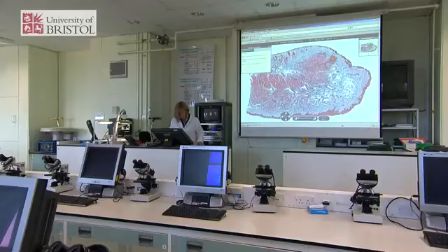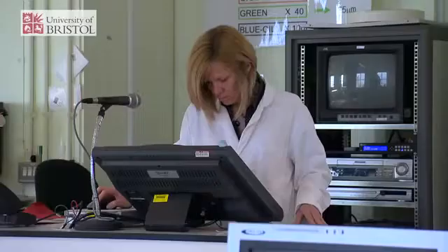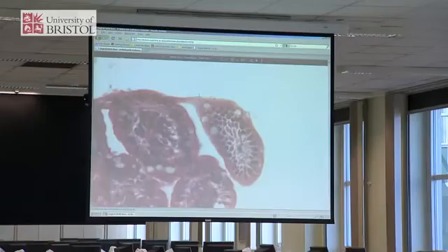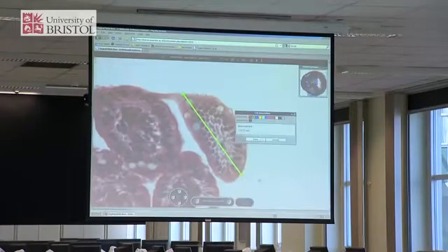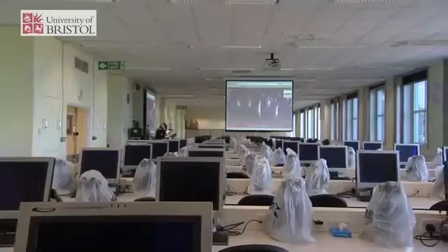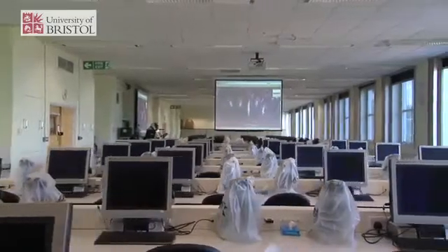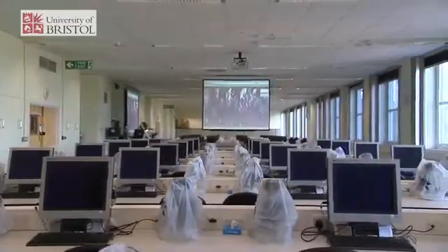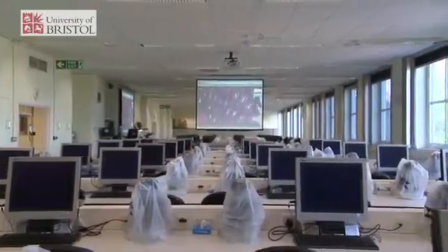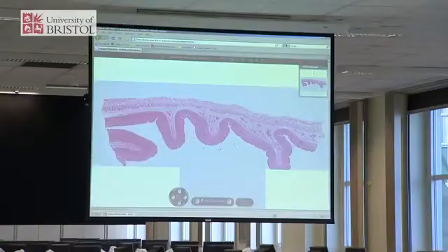The virtual microscope that we have is a fantastic resource for teaching students because within the class lab we can ensure that all students are viewing the same section at the same time. It's very easy to look at images on the screen and to talk about what you're seeing and explain what it is that students are seeing. Students also have 24-hour access to the specimens on the virtual microscope from wherever they happen to be.